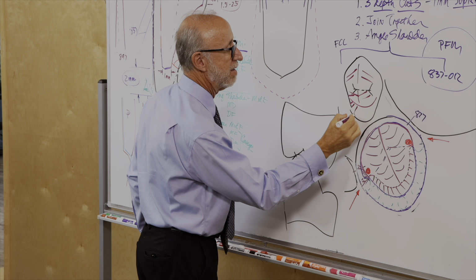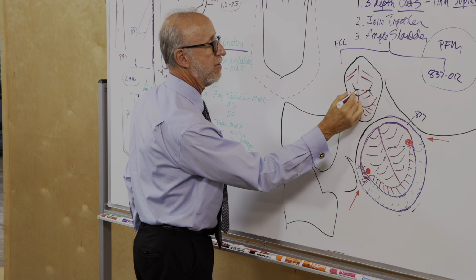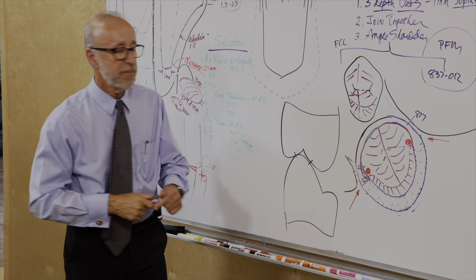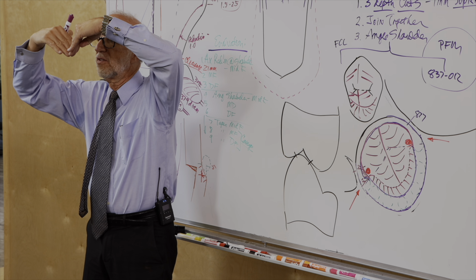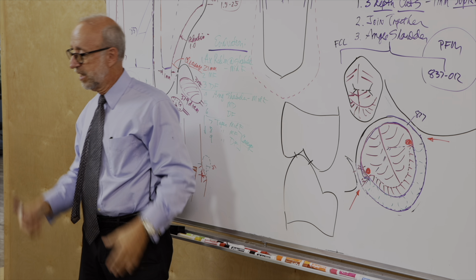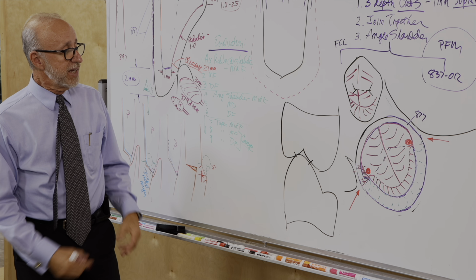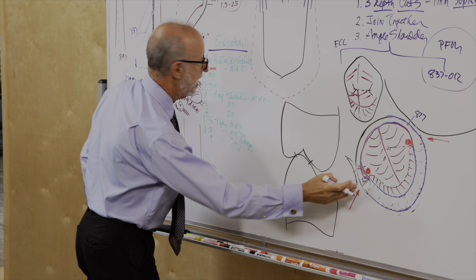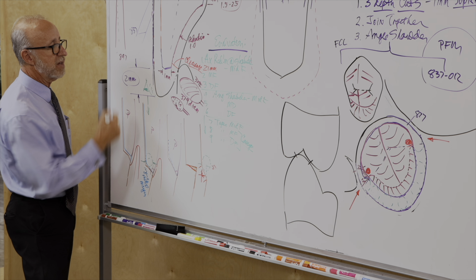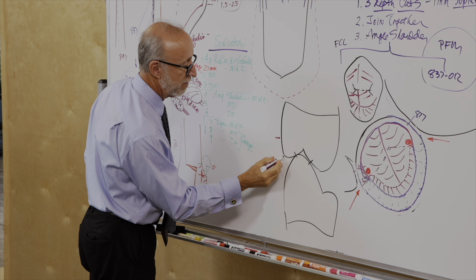Not everybody is getting the A, B, and C parts figured out. Some of you yesterday were not making a ridge here on the B-plane, so your B-plane wasn't really matching the space between the two opposing teeth and getting equal clearance on both sides. We'll try to do a little bit better on that now. But the key thing you need to realize is that we've talked about the canine and 2 millimeters reduction and lots of porcelain over the incisal edge for the aesthetics. And we're going to do the same thing over here.